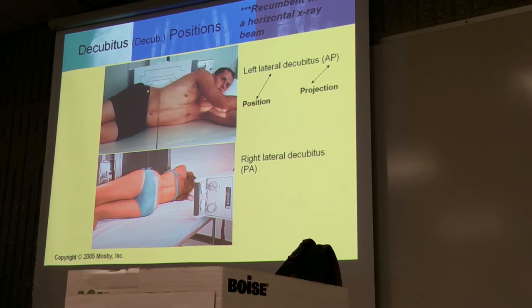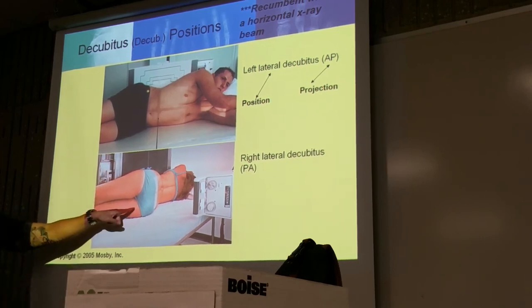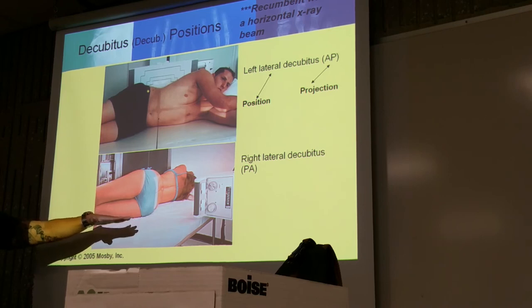And no, you can say lateral. It's a lateral ventral decubitus. Because of the horizontal beam, you already assume that for ventral it's going to be lateral, since the beam is entering on the lateral side. If someone were laying on their stomach or back and the beam is coming from the top, now it's different. But why would you choose one over the other?